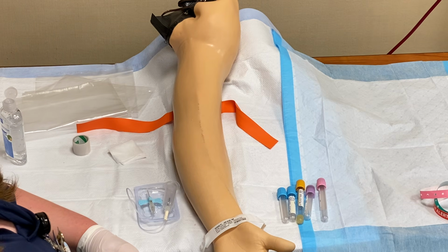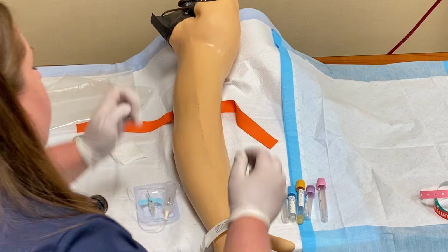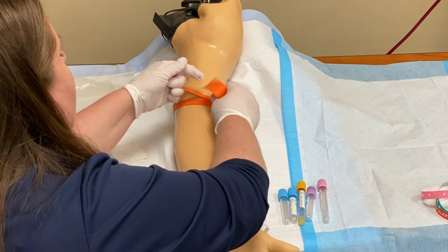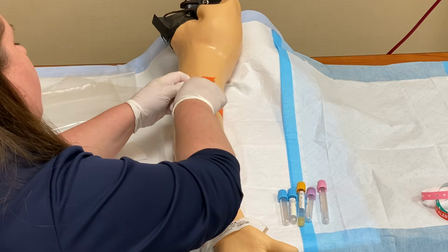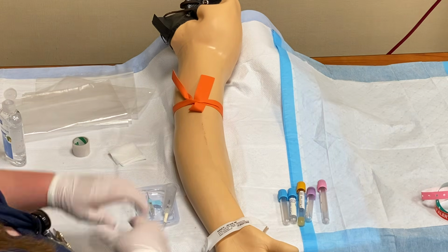So after my 30 seconds is up, I'm gonna look at the arm, make sure it looks nice and dry, and then I'm gonna put my tourniquet back on. I wanna make sure that I do not contaminate the area I just cleaned. And for phlebotomy, I want my tourniquet to be about 3 to 5 inches over the insertion site.